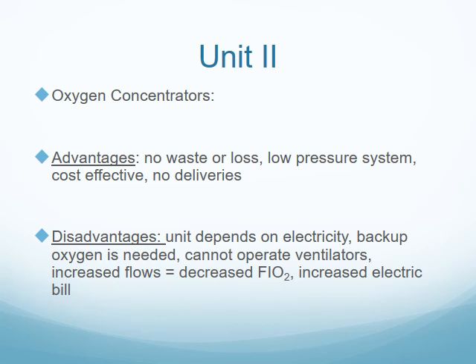When we're looking at oxygen concentrators' advantages and disadvantages, an advantage is there's no waste or loss. It can be used as a low pressure system. It's very cost effective and you don't have to worry about running out of oxygen or waiting for an O2 tank delivery. It generates its own oxygen.